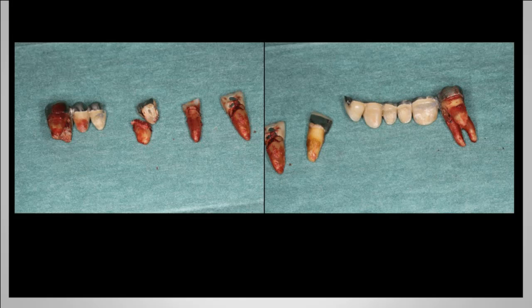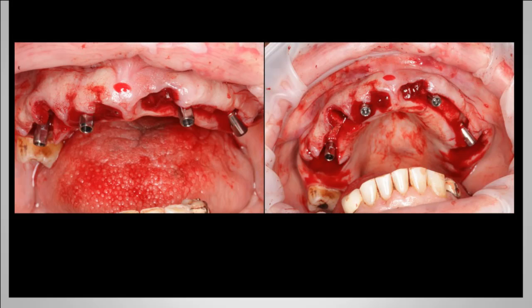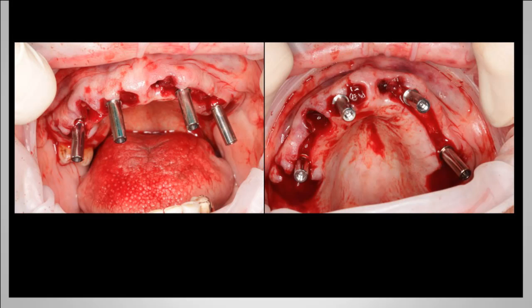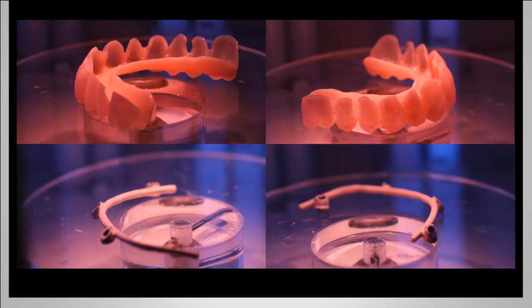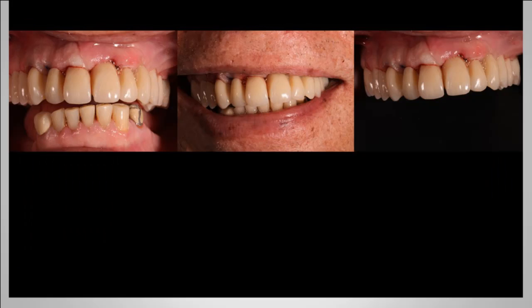Once we've removed the bridges, we're then able to place the implants immediately, which you can see here in situ. Once we've placed the implants, we're then able to connect up the abutments, and what you can see here is the Dentsply implants component. This is called the SmartFix abutment, sorry, the balance-based angled abutment. With that, we put the welding components on, welded a framework, used a shell, picked the shell up in the mouth, so that we've been able to construct on the day this provisional restoration.